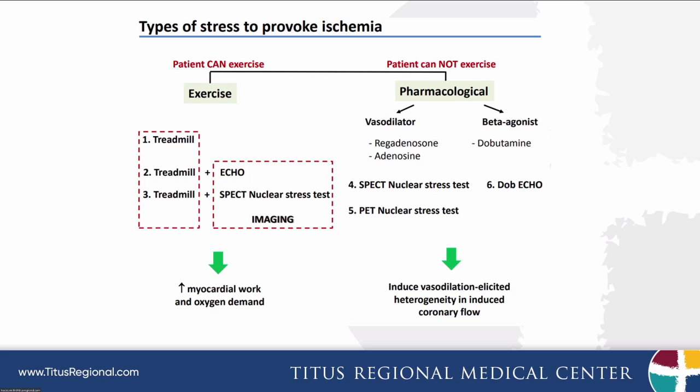On the other hand, if a patient cannot exercise, then we have options of a dobutamine echo examination, or we have the option of doing a nuclear stress test with a vasodilator. The most common one that we use here is Lexiscan.